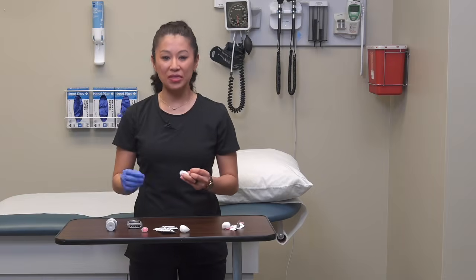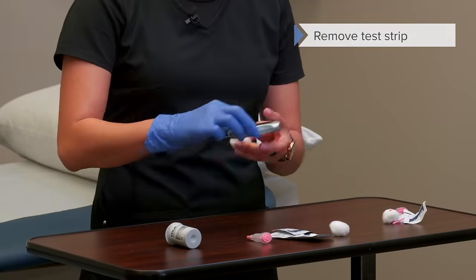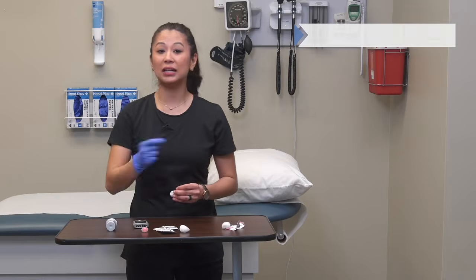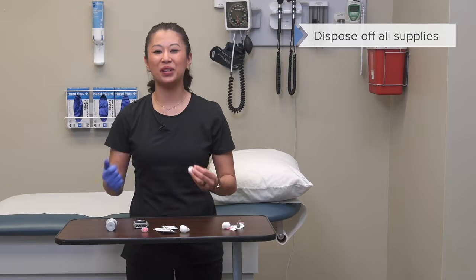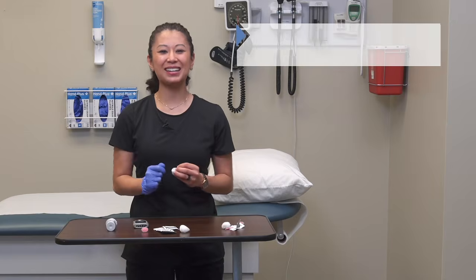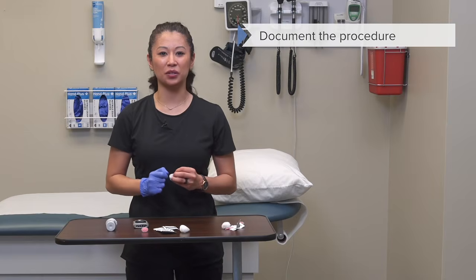But once we've gotten this, we can remove our test strip from our meter. We can dispose of this, discard the lancet in the sharps box, our supplies into the proper wastebasket, remove our gloves, perform our hand hygiene, and of course, document the procedure.